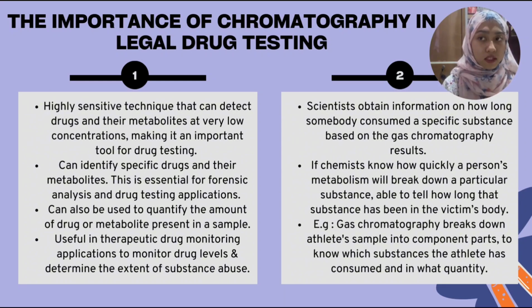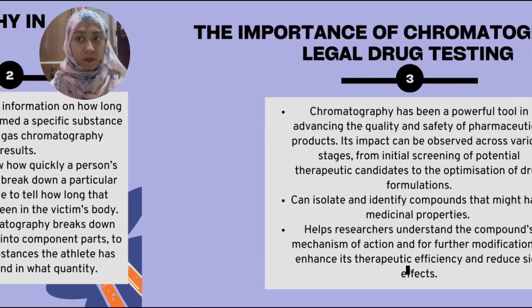Another example is the Olympics, and the Winter Olympics in particular, often catch athletes for having drugs in their blood or urine samples. Gas chromatography breaks down the athlete's sample into component parts, so it's easy to tell which substance the athlete has consumed and in what quantity.